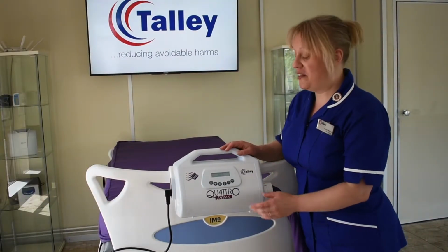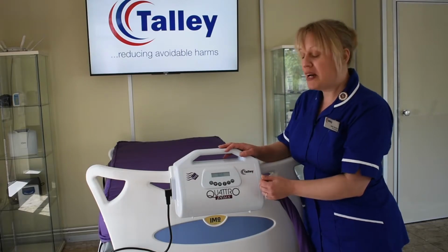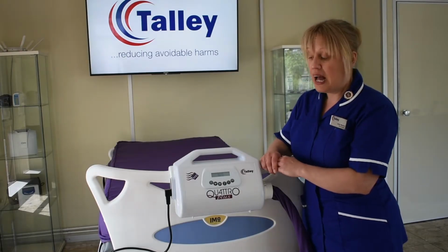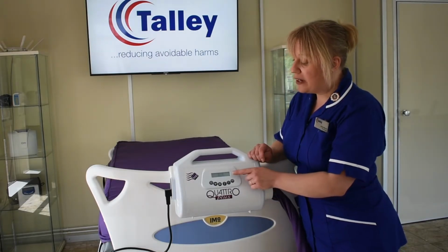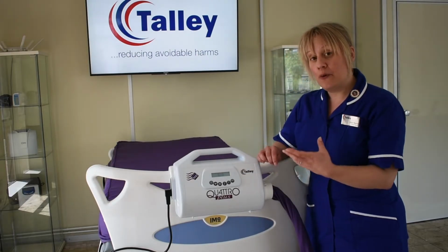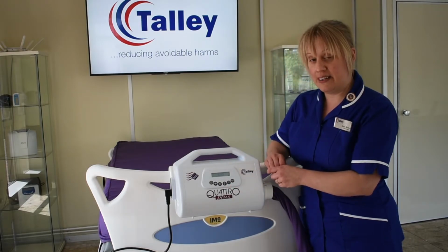So the first thing I want to do is just explain to you the default screen as and when your mattress is inflated. Once your mattress is inflated, it will automatically default to active medium. Active just means that the mattress is alternating under the patient in a 1 in 4 cell cycle, and the medium is purely a comfort setting. You will also notice that after 2 minutes of inactivity, a little padlock will appear on the screen. That padlock automatically comes on after 2 minutes for safety reasons, so we will always need to unlock our power unit before we can use any of the functions on the power unit itself.